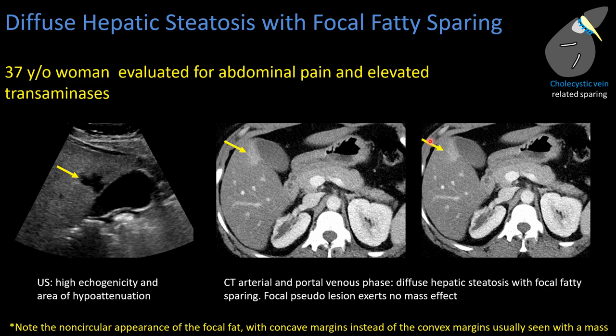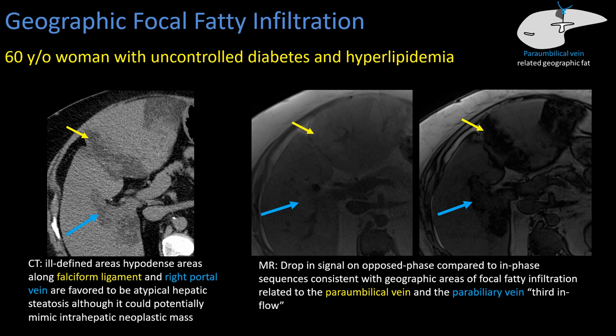This is a patient with uncontrolled diabetes and hyperlipidemia who presented for CT. We see multiple geographic areas of low attenuation — one near the gallbladder fossa, one anterior to the right portal vein, and one along the falciform ligament in a more atypical location in segment two. On opposed-phase MRI imaging compared to in-phase imaging, these areas demonstrate signal loss, consistent with focal fat deposition likely related to periumbilical and peribiliary venous drainage, or third inflow, in this patient with hyperlipidemia and diabetes.